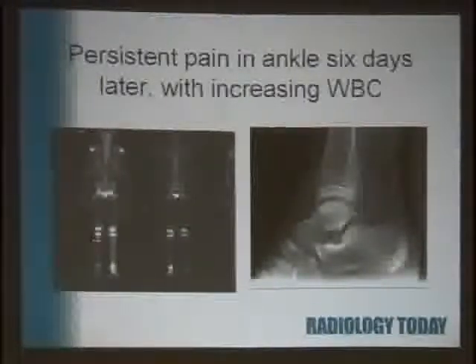But here's the problem with the bone scan. It does a very good job of showing where the abnormal activity is, and it lets you look at the whole body, which particularly with a little kid who can't talk and sometimes you can't tell, that can be helpful. But it only tells you that there's increased activity. It doesn't narrow it down at all. It could be a fracture, it could be a tumor, it could be an infection.